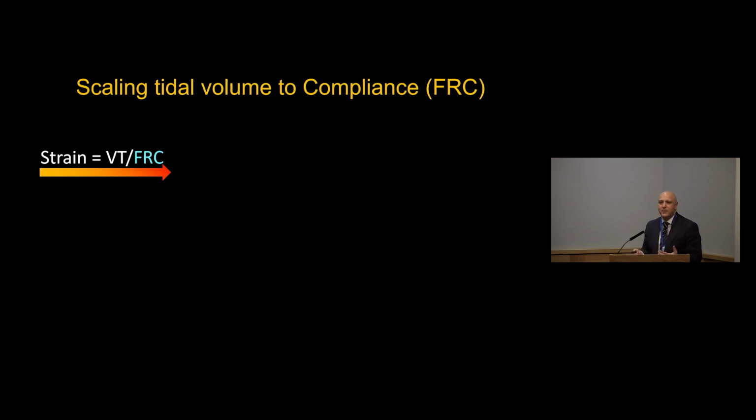Question is, how many people in this room measure the FRC? Not all at once. Okay, so if my calculation is right, nobody. And I think what we can see is that this is very difficult. There's only one ventilator that can measure FRC, and even that with some issues.